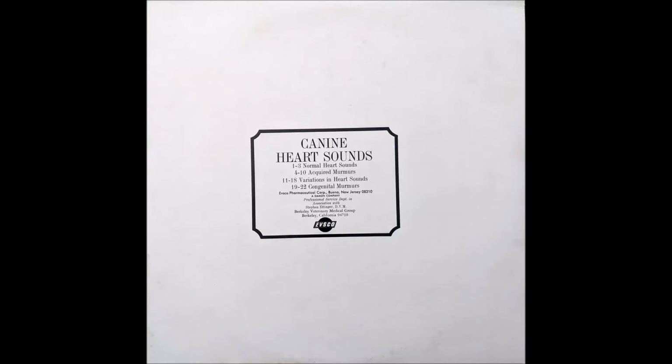The thorax is auscultated systematically by valve area. With the dog standing on 4 legs, the mitral valve region is just dorsal to the left caudal sternal border from intercostal spaces 5 to 6.